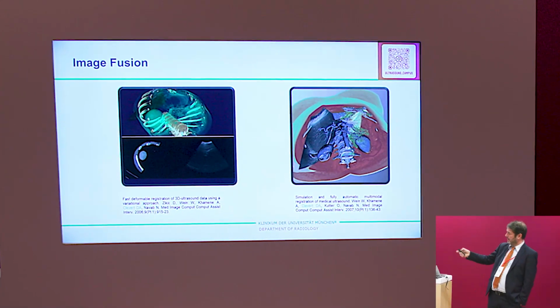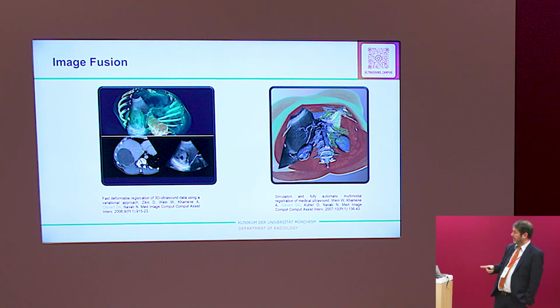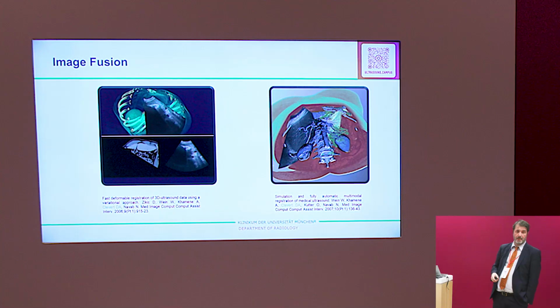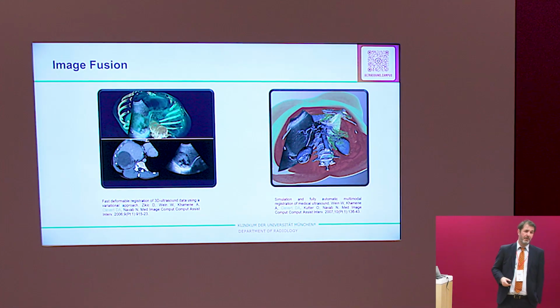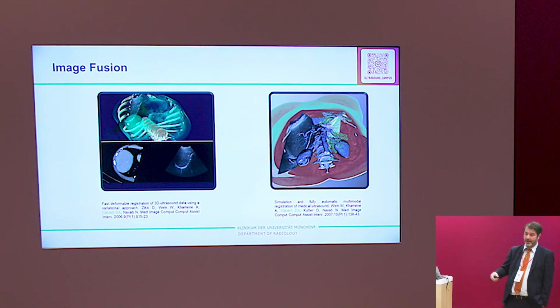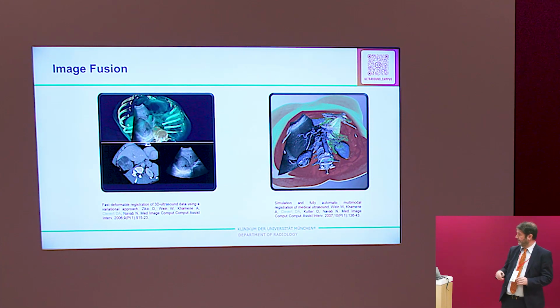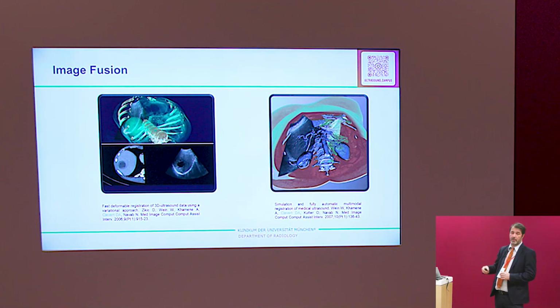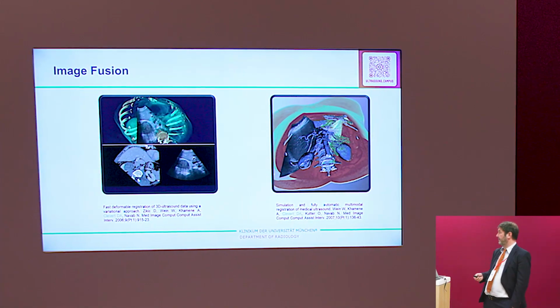But if you see these images over there, they're more than 20 years old. But you see registration, ultrasound and CT, even at this time it works. We had no bracket for the probe. We used some glue to connect the sensor to the probe. And we also had no patient tracker, so if the patient moved a little bit, we had to start from zero. But even if you look at this paper, which was published in 2006 and 2007, from the data from 2005, it works pretty well.